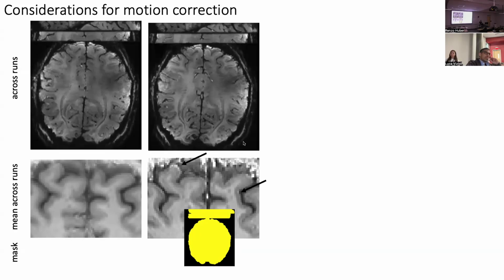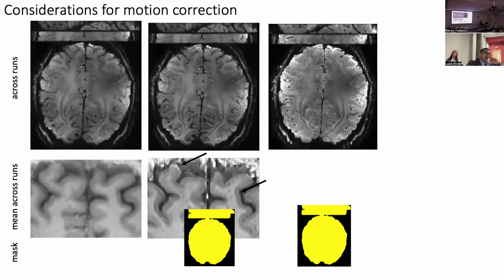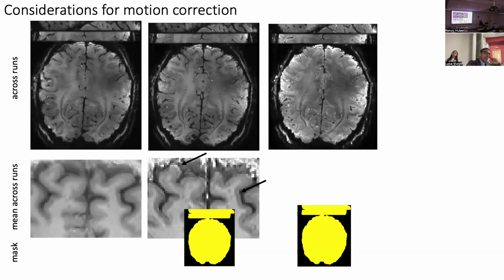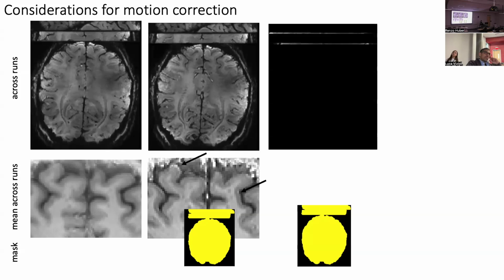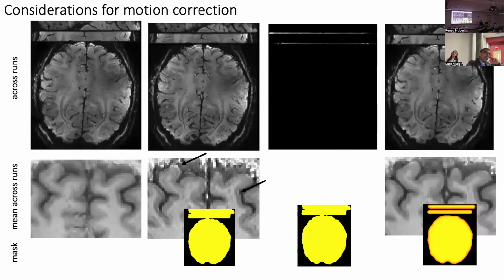And this is even the best case. Here I'm looking at an inversion recovery EPI fMRI dataset. If I would use a gradient-echo dataset for that, that doesn't have such high structural contrast, then very often, at least in AFNI, and in both SPM and ANTs, in fact, it tries to move the slab completely out of the field of view, and then you end up with nothing. And I'm cycling through different runs here.